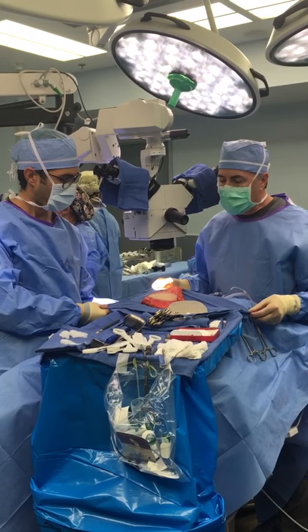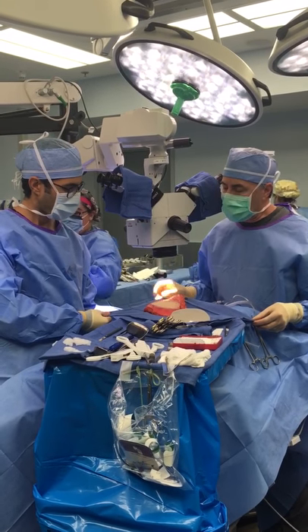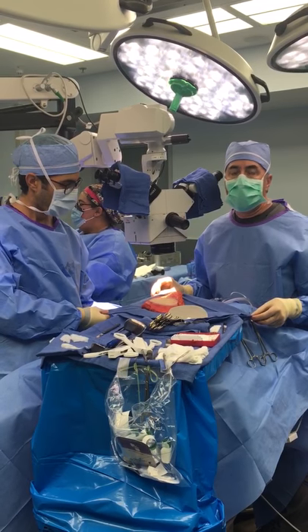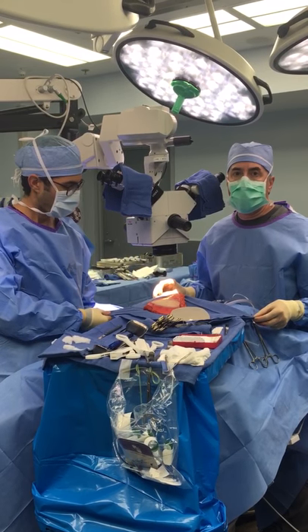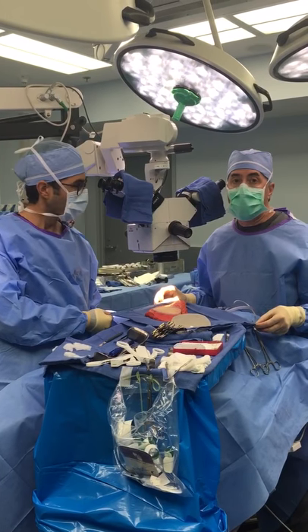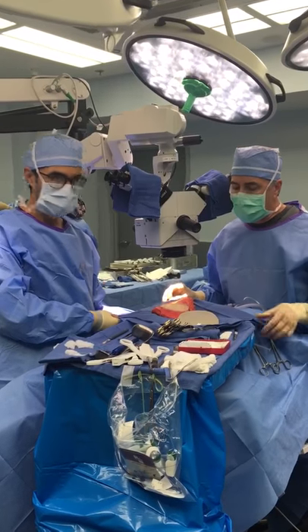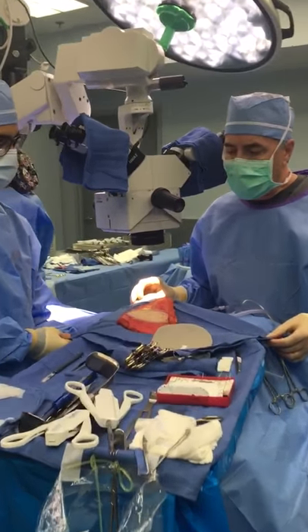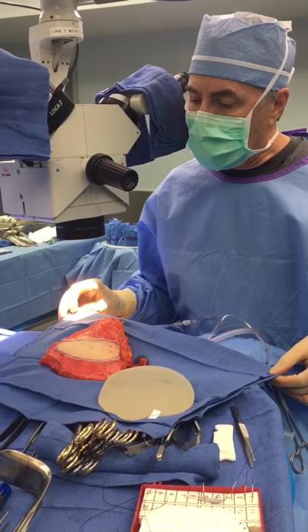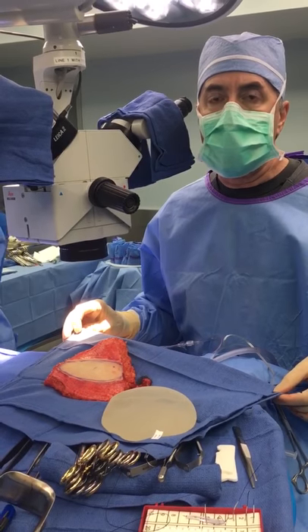Dr. Garza took out the implant, the capsule, and the dermal matrix, and we're going to replace that today with a DIEP flap. Dr. Garza has put the pectoralis major muscle back down in its anatomic position, and then we'll put the flap on top of the pec muscle as we usually do. You can see the volume match is pretty close — this is a 440 cc implant, and I think our size match is going to be pretty close with our lower abdominal tissue.